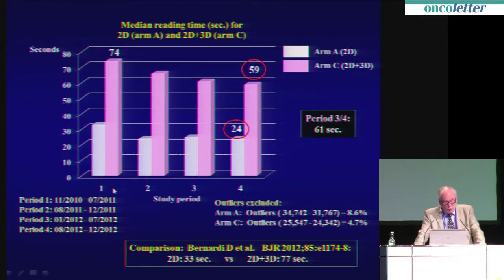We had an automatic interpretation recording in our Oslo trial. That means when a reader logged into a case, the seconds were automatically recorded by the computer, and it was stopped when he clicked the conclusion. So all the readers in all arms were automatically recorded. I'm very happy and grateful to my colleagues for accepting that.